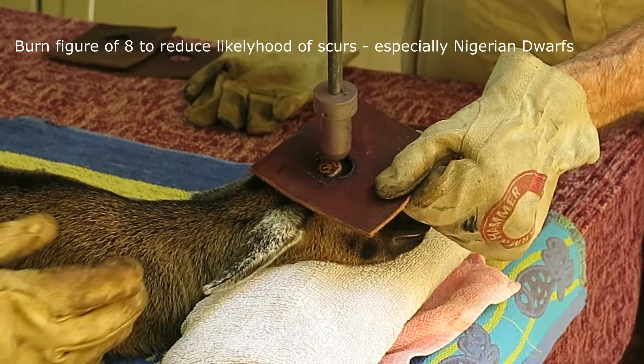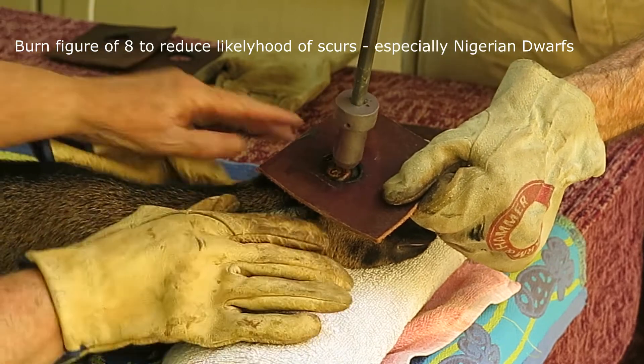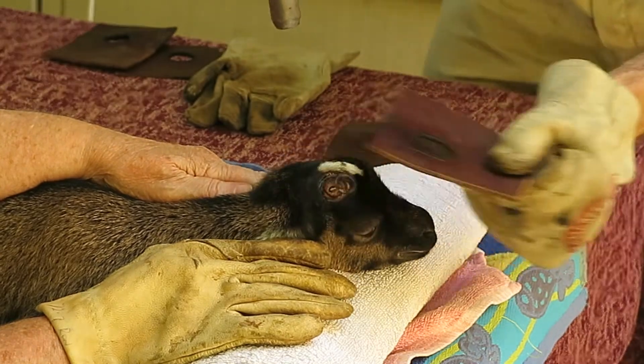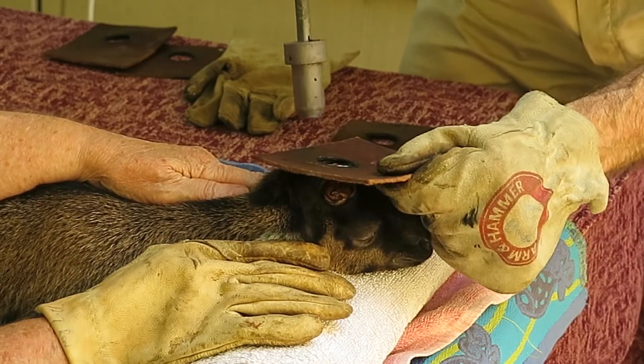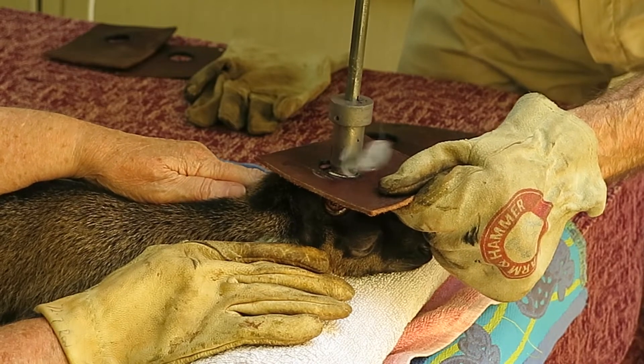Another leather square is used and the central area is burnt until it also has that copper colour. Now a smaller hot iron is used, just rostral and medial to the original burn. This is commonly referred to as a figure of eight burn.